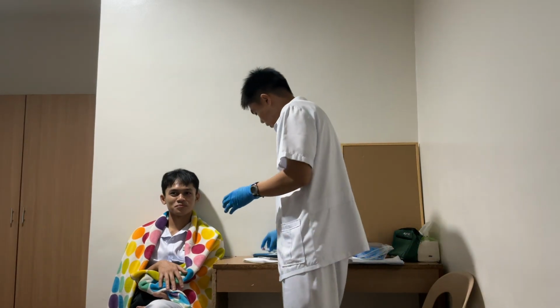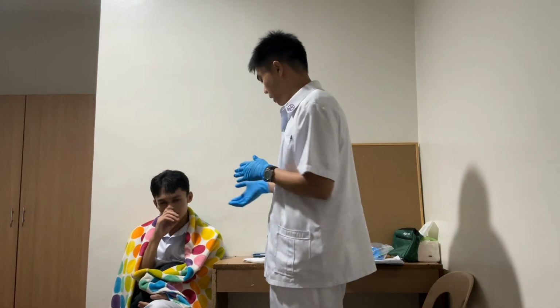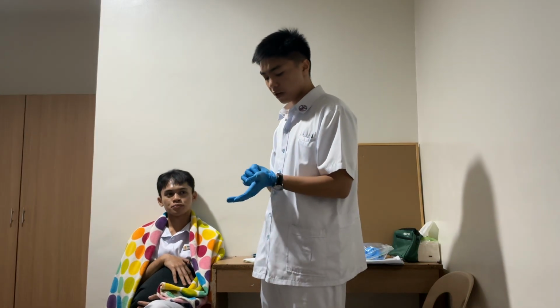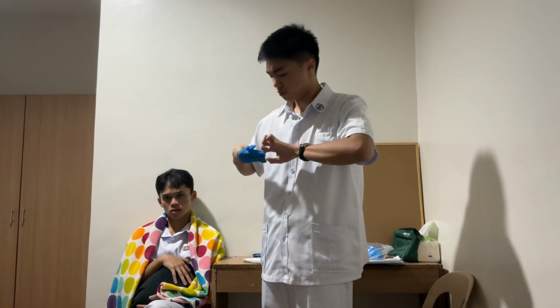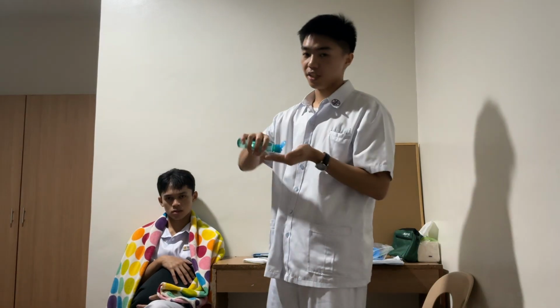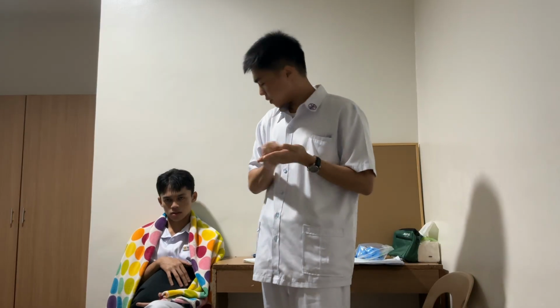So again, I have already recorded the temperature and will ensure that I pass this on to the concerned physician. So with that, we can now discard the gloves and then prepare for our next procedure. So discard gloves. Do proper hand washing, to prevent the spread of microorganisms. Okay? So if you can wash the thermometer and it does not break, you can also do so now. Okay? So we have already stored it and it's ready for the next steps.